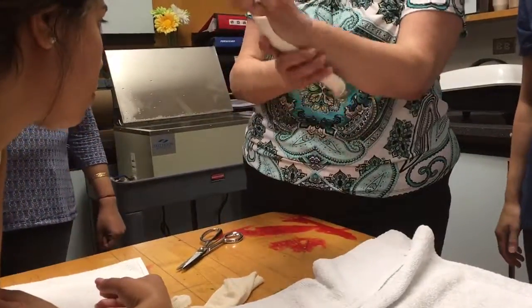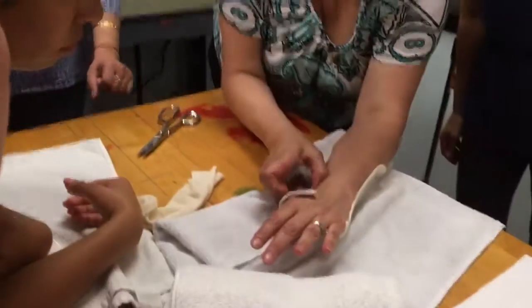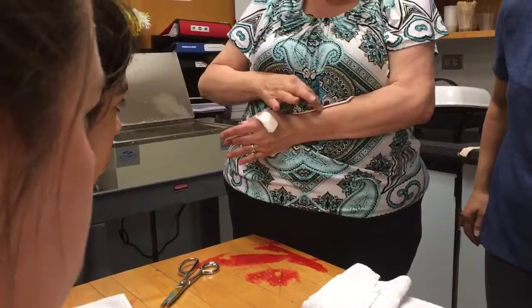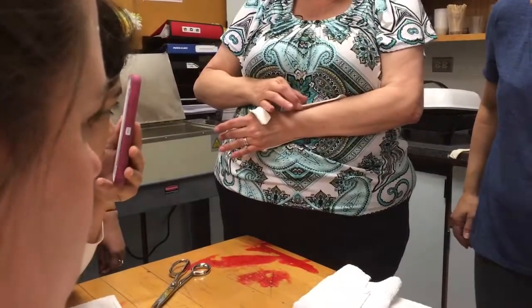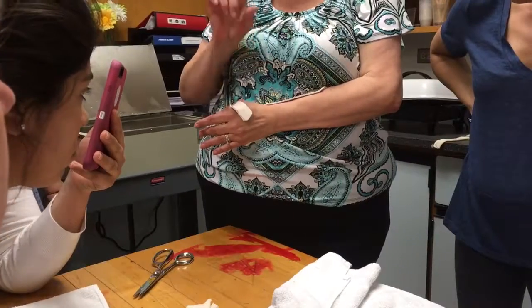I could either cut it or I could just loosen it. When you loosen, you don't just tug in one section — you do this, look. Because if you just put your finger in and pull in that one section, you're going to get a little cup in there.